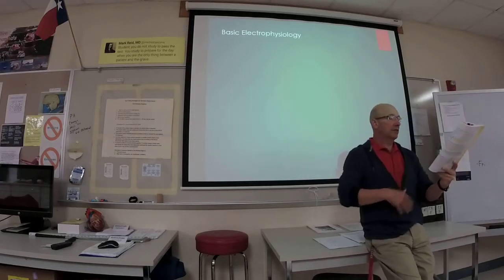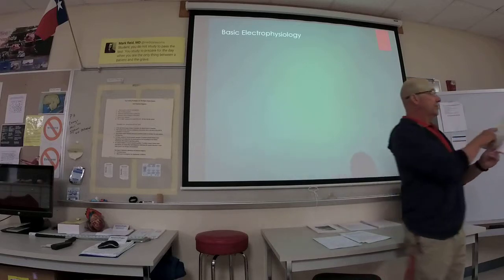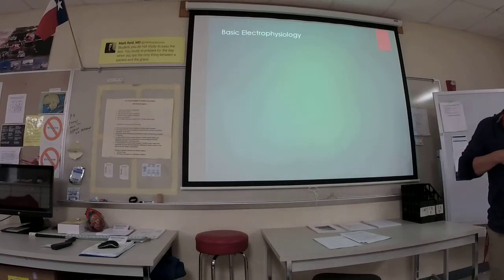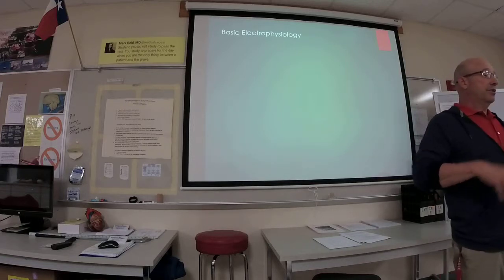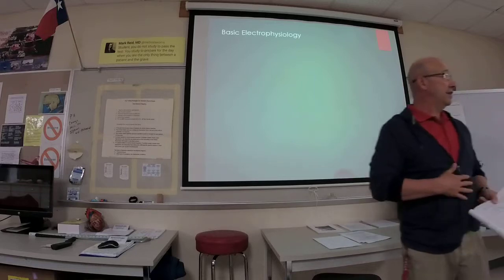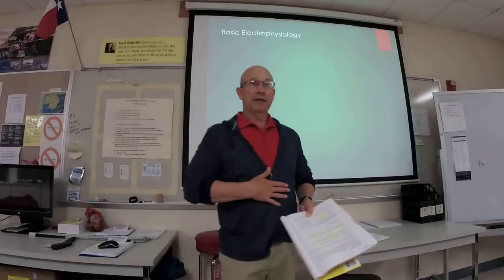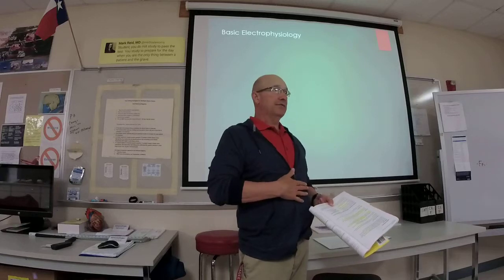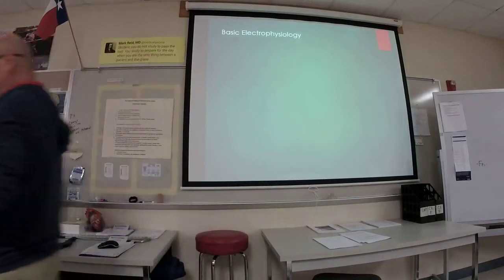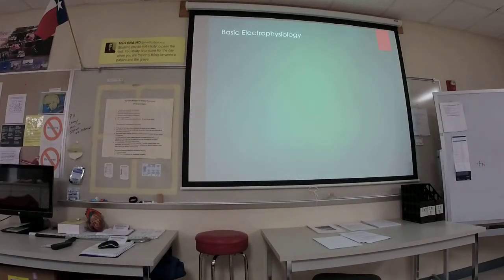Pregnancy, you may have to move them. It says do not place the electrode on the abdomen for any reason. So again, excellent test question, right? You're doing a 12 lead, or you may have to put them on a small pillow. Keep the weight of the uterus off the inferior vena cava. We'll talk about that, but it's called vena cava hypotensive syndrome, where the baby is sitting on the vena cava, which produces low blood pressure.